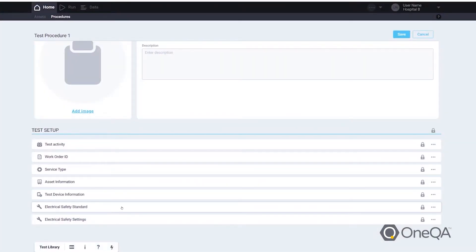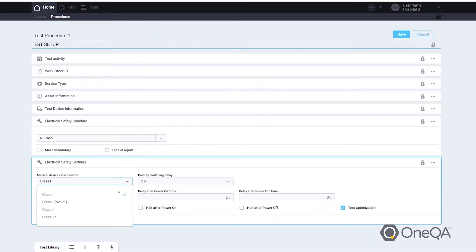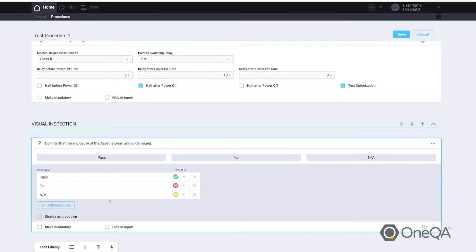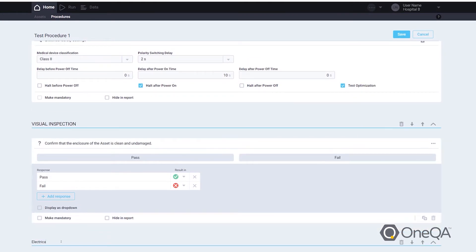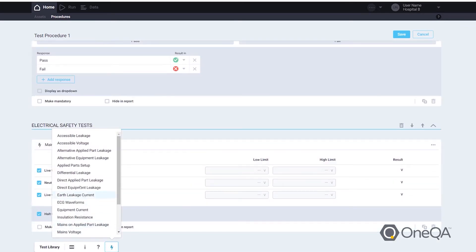OneQA gives you the capability to make a report with a simple drag-and-drop component builder tool. That tool allows you to take all elements related to electrical safety or impulse defibrillator testing and build a simple procedure where the building blocks intuitively define each step that needs to be done. Once it's saved and executed, anyone in your organization using OneQA can use that exact same procedure.